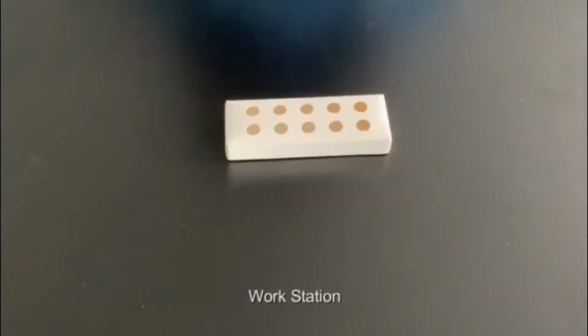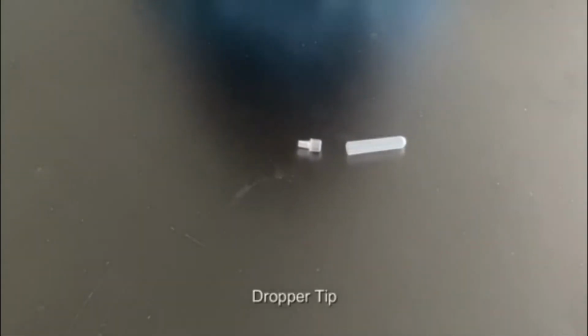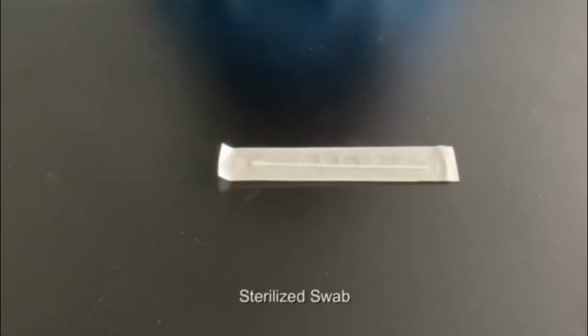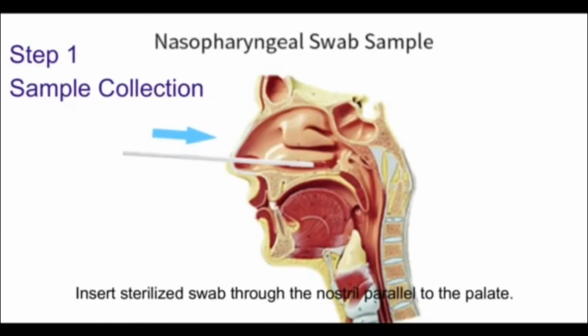Test cassette, workstation, extraction tube, dropper tip, extraction reagent, sterilized swab. The detection steps include: insert sterilized swab through the nostril parallel to the palate.